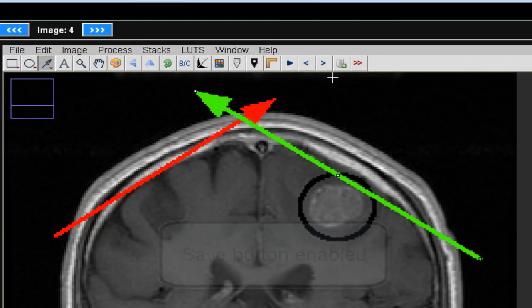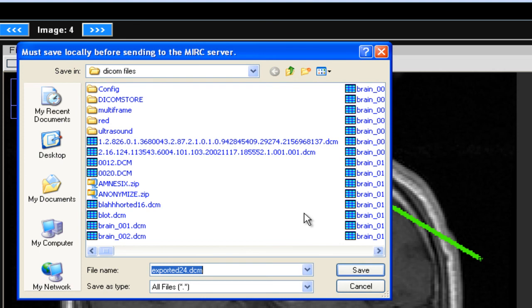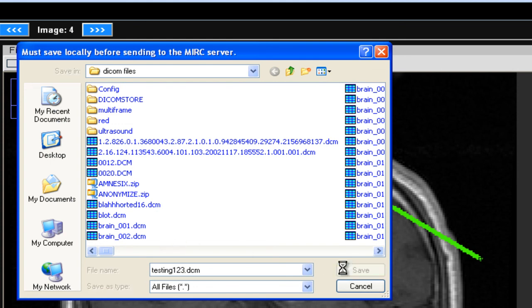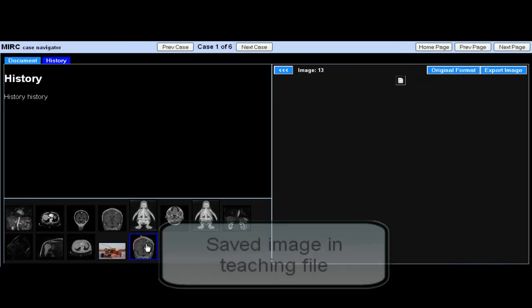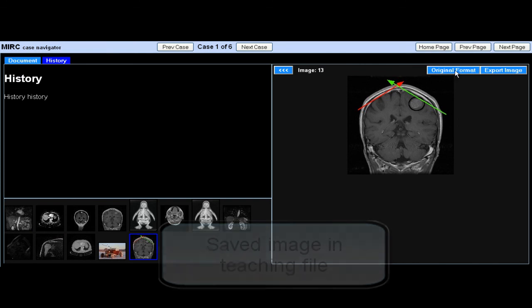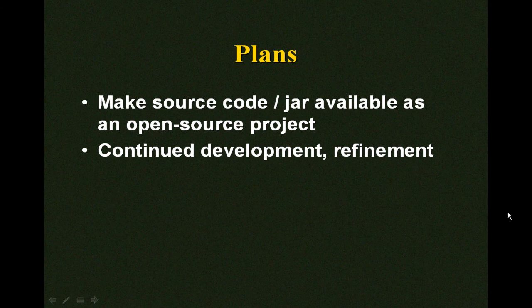If the user can edit the image, the button is enabled and a different icon is shown. When the button is pressed, the image is first saved on the user's local machine. The file is then sent to the MIRC server, and the saved file is automatically routed to the case where the original image is stored. In the future, we plan to make the source code and JAR file available as part of an open source project. The editor is stable and has been tested in Firefox and Internet Explorer 7 and 8. We plan to refine the editor and extend it based on feedback from users.